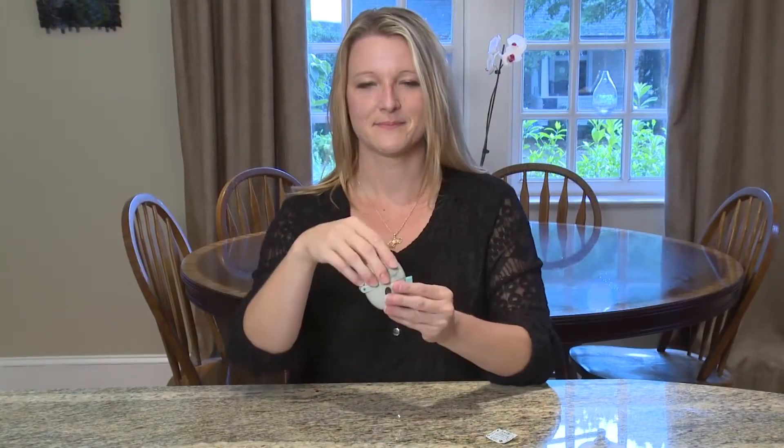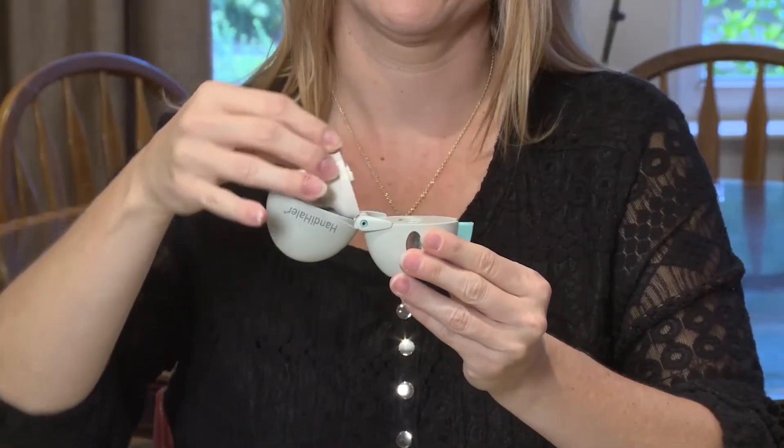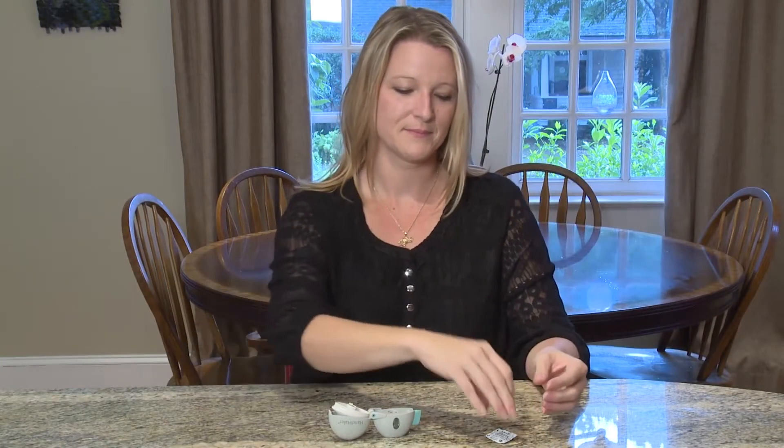First, open the Handihaler cap by flipping the cap to the side. Then open the mouthpiece by flipping it in the same direction as the cap. Put your Handihaler on a flat table or counter.